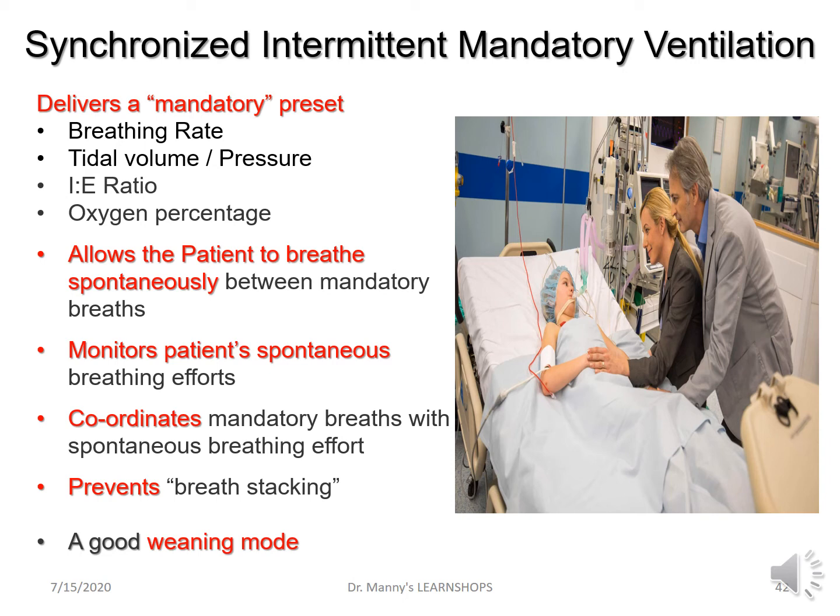So synchronized intermittent mandatory ventilation is considered a good weaning mode, even though it hasn't been proven in the research or evidence-based practice to be any more effective than any other modes.